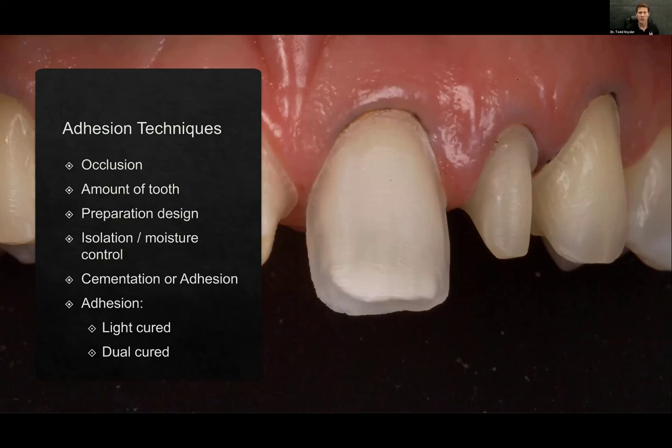So we're thinking of all of these things during the diagnostic phase. We're thinking about it again right here at the preparation phase. You know, we're starting to just get ready to start taking impressions and photographs of things. It's like, you know what? I just want to make sure I can do what I want. And if I can, right now is the time you want to make that decision if you're going to call an audible. Okay. All right.